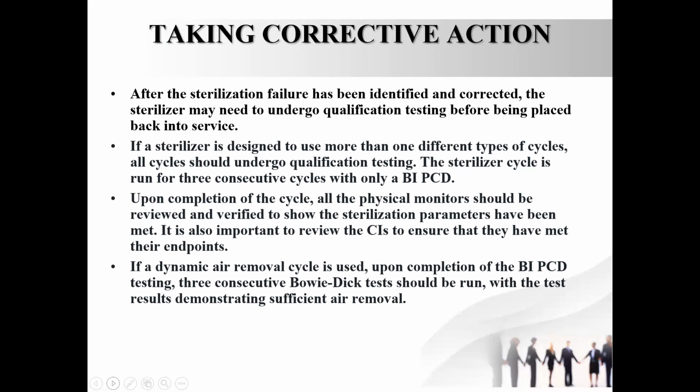Then after you complete the cycle, check the physical monitors, gauges, graphs, and printouts. And if you have put any chemical indicators in the load, please check those also. And if it is a pre-vacuum sterilizer, which is now called a dynamic air removal sterilizer, then you have to do 3 consecutive Bowie and Dick tests also and see that they pass for proper air removal.